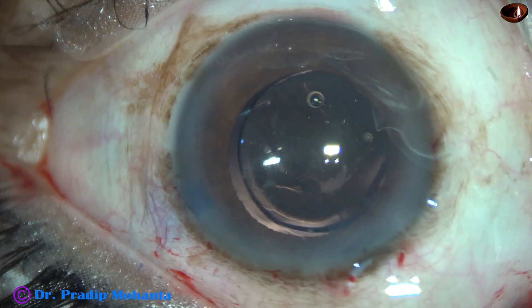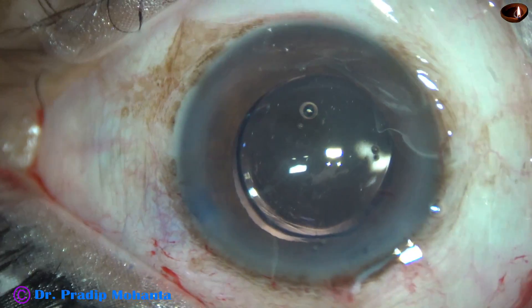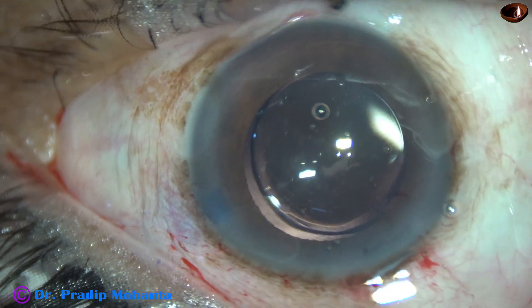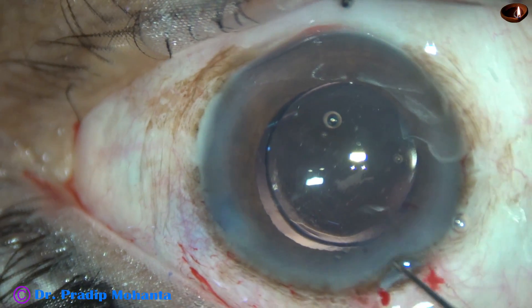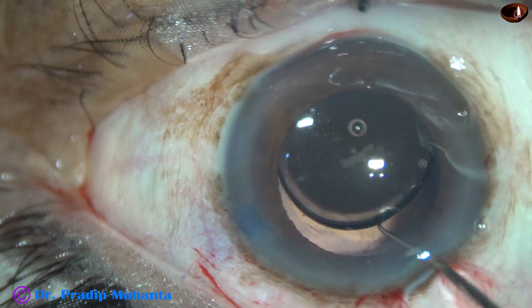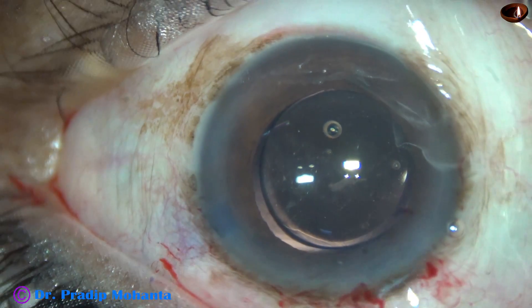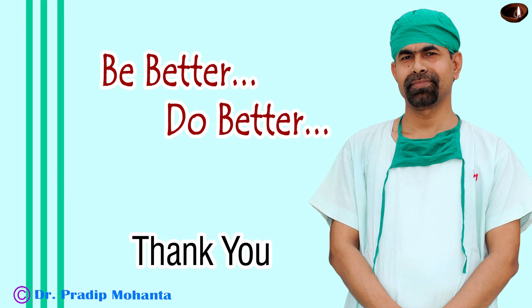This is a very nice technique of implanting the lens in the capsular bag. I learned this technique from my guru, Dr. Suhas Haldipurkar, of Lakshmi Eye Institute, Panvel, Maharashtra. That's it. Thank you very much for your attention. Hope this video will help you in developing your surgical skills.